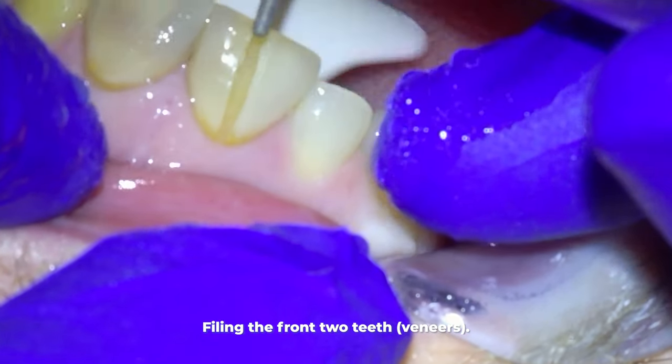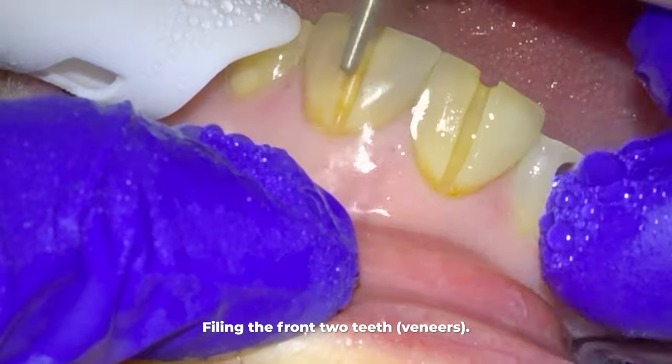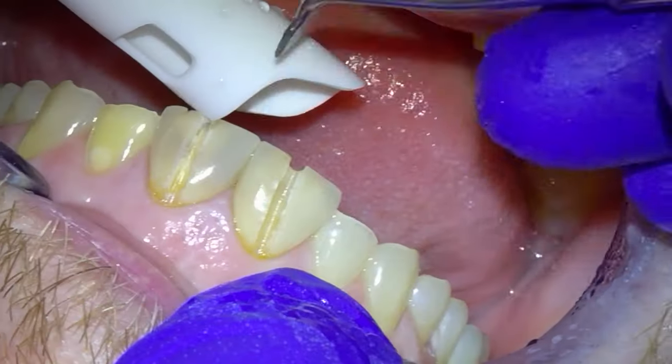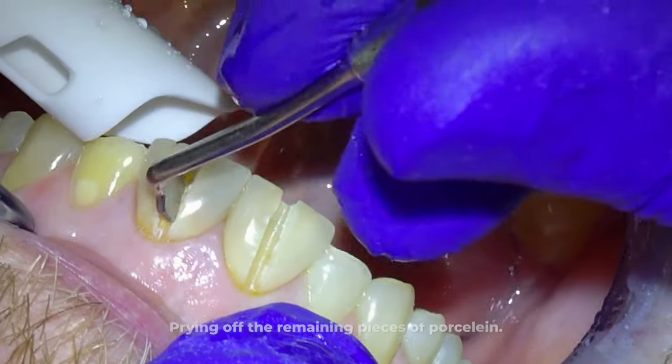By the way, these veneers are so dark because of stains that got under them a long time ago. Because the veneers are so old, they used an old type of cement that wasn't very good at sealing off foreign substances, so staining eventually leaked into these.